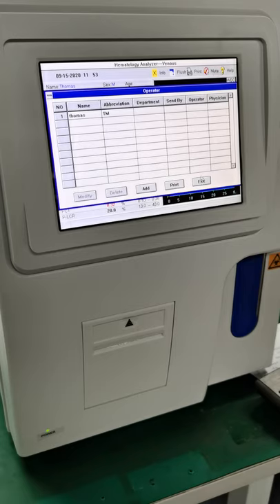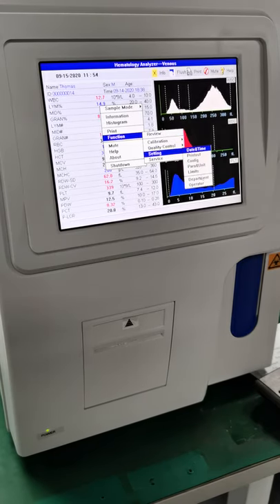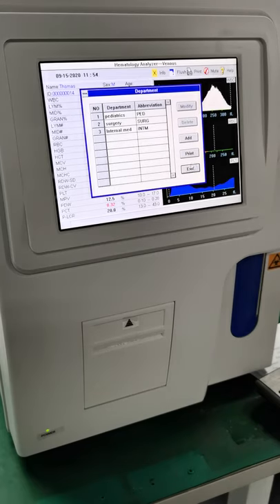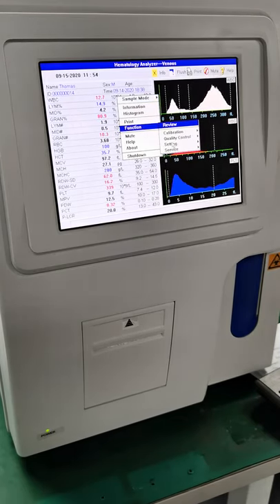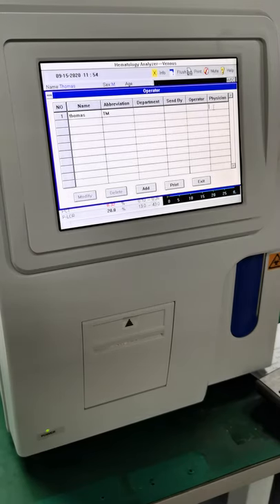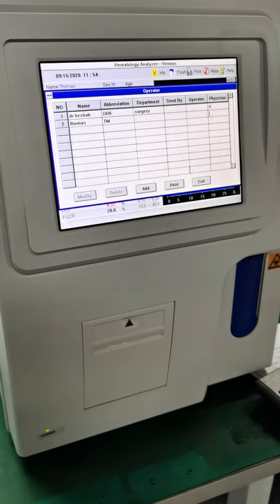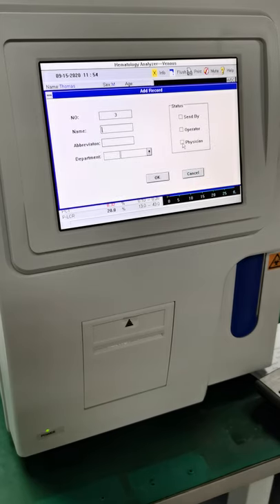And physician also, you can go back to function, and then settings, and then department. Department is done. Again, settings and operator. Okay, we can go to physician also, this part, and we add something like Dr. Keshav, let's say DRK, and physician, yeah, you can use this physician, okay? Departments, maybe this doctor is from surgery. Let's suppose, done, okay? And if you want to add more, just click add button and physician, right?